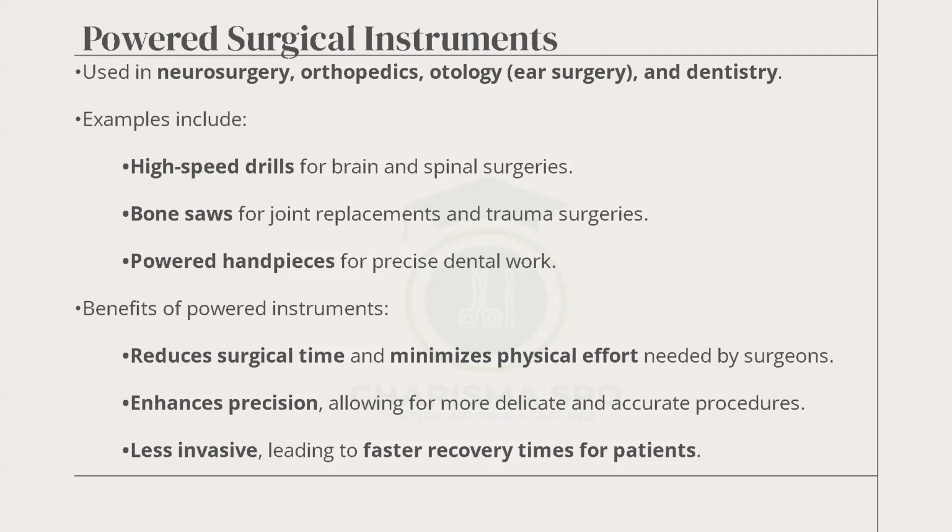Examples are high-speed drills for brain and spinal surgeries, and bone saws for joint replacement and trauma surgery. For the bone saws, they mount the blade on an attachment that is mounted on a handpiece.